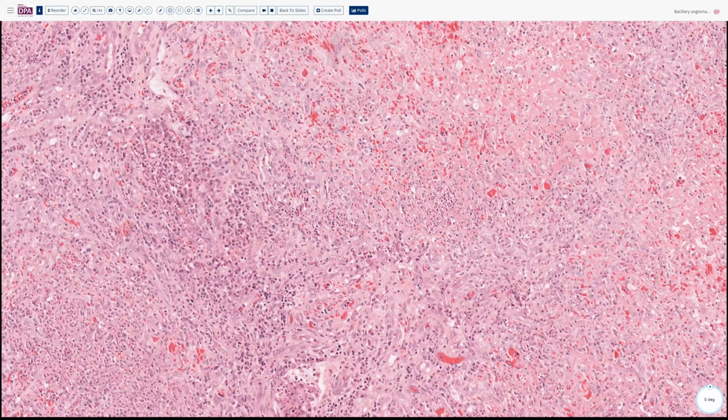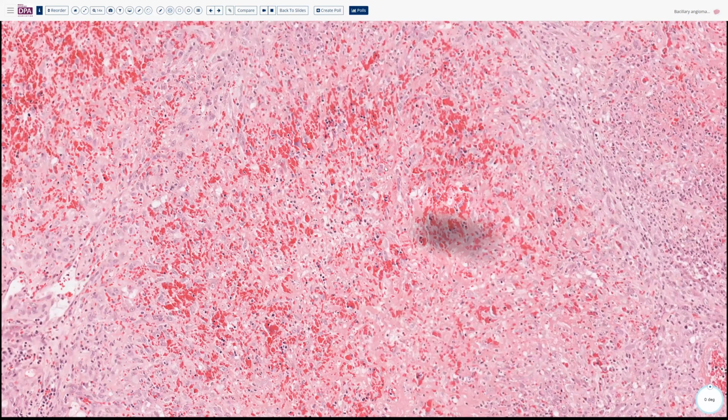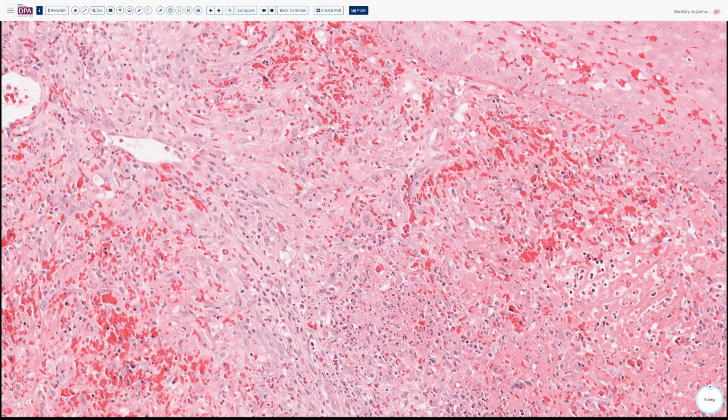So as you come back and study these, wander around until you can fairly easily identify the potential targets where you'd be looking for the silver stain to show you the bacteria. Notice here we have almost a little bit of necrosis or acute inflammatory response to some of these. But I think here, if we come in here, maybe some of that type of material, or some of this more fibrinoid material here could be areas where you would identify the culprit bacteria.